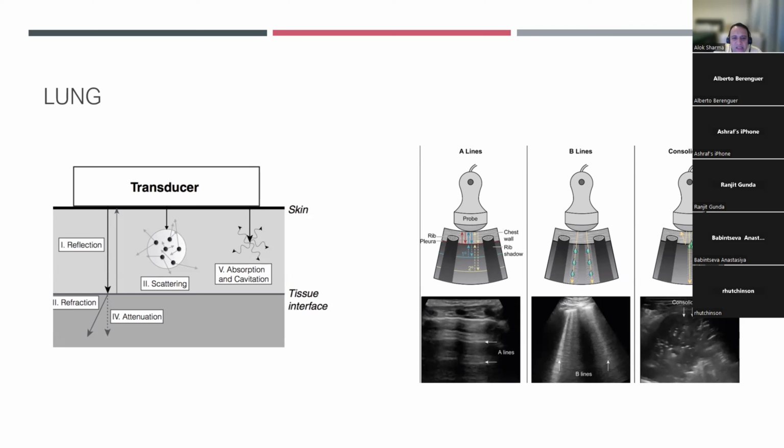What I'd say is that if you're using a frequency that is relatively low, it will penetrate deeper. But because it will have to interact with a lot of tissue, it will attenuate. For that reason, you can see the deeper areas with the probe that has a lower frequency, but its resolution will not be so good. We will cover that concept again, but just to say, you can see how reflection is happening.